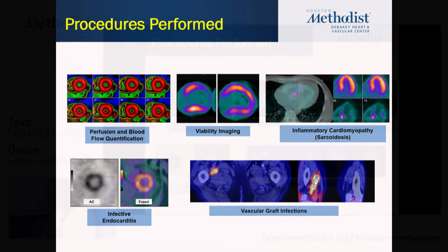Okay. We've got another question. PET CT and cardiac masses. Any information for surgeons? Yeah, it will help you to detect, especially in metastasis, how far it is involved, and because most cardiac tumors are metastatic, if you want to look for benign versus malignant in patients who have other types of cardiac masses, obviously it has to be prepared in a way that you suppress the normal myocardial uptake.